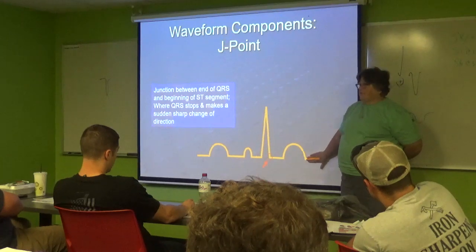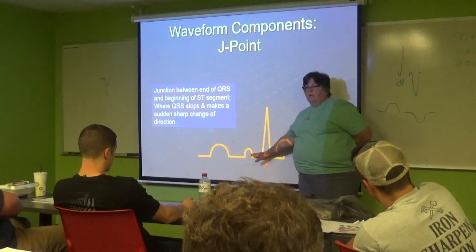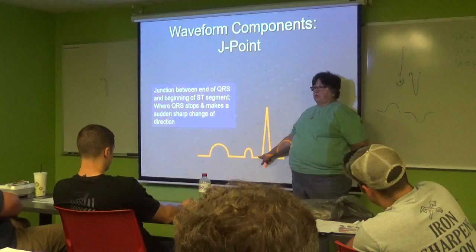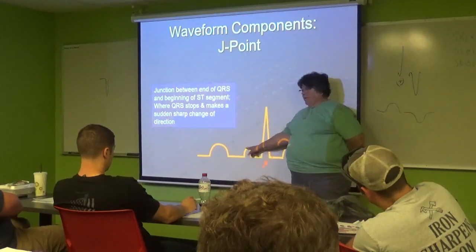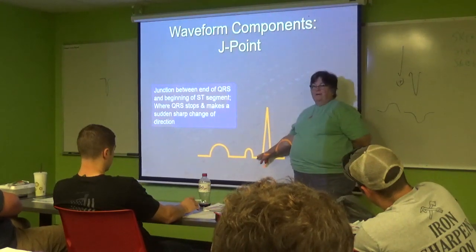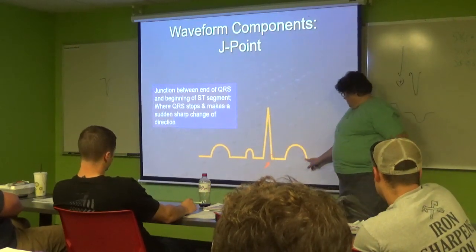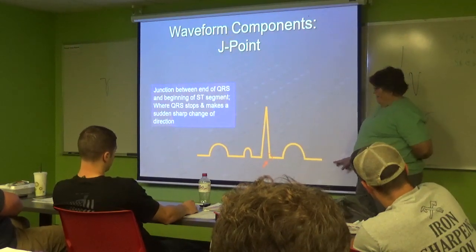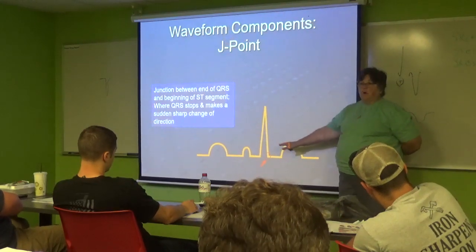So you want to go past the T wave. Does anybody want to go this way towards this? Match it here? Because that's the mistake that's always made. This is not isoelectric. This is your AV node. Remember your electrical current we talked about? SA node, AV node. QRS, this is the middle of the cycle. This is not isoelectric. This is repolarization. This is flatline isoelectric waiting for the next impulse. So this J point gets measured to this and not before.